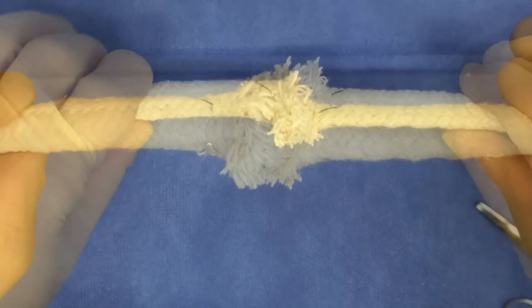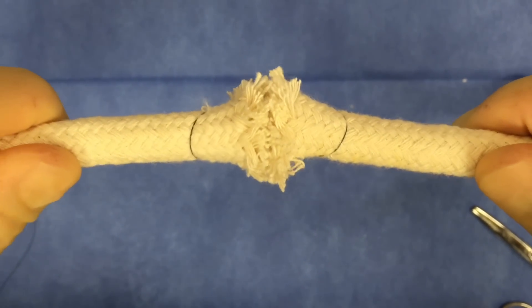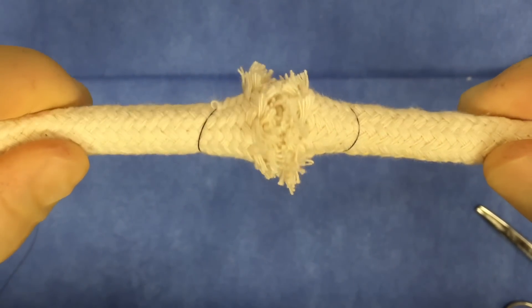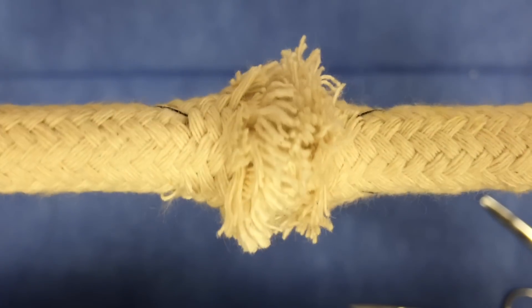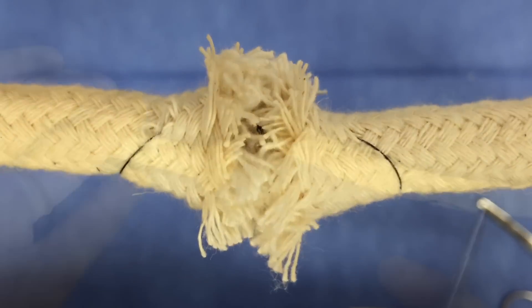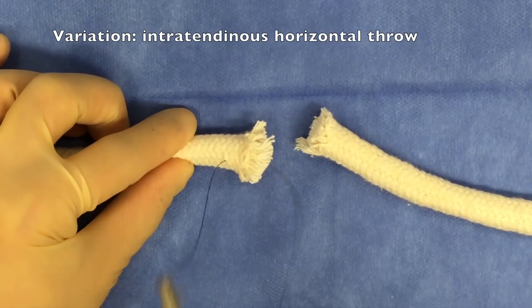When performed correctly, this grasping suture will provide additional strength that you don't get with a simple interrupted suture, which actually squeezes those fibers of the tendon together and adds more tensile strength for the healing of that tendon. There are a lot of variations on this same technique.